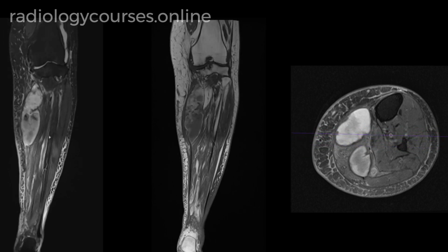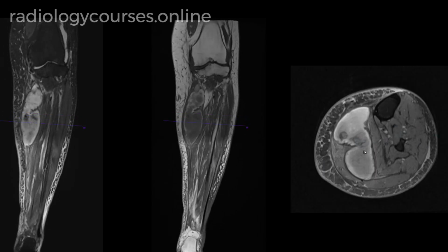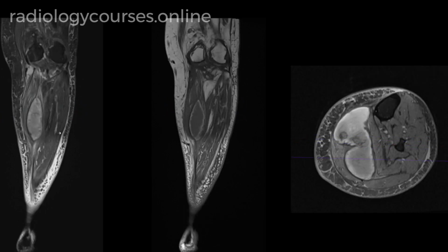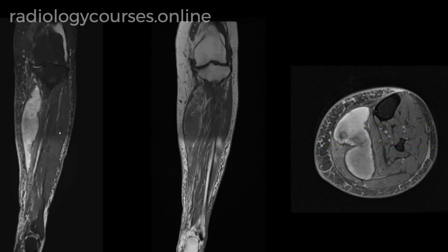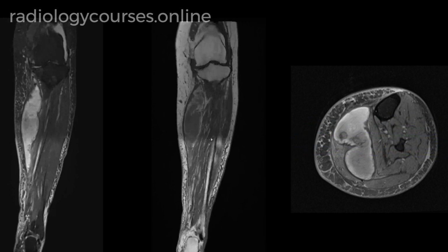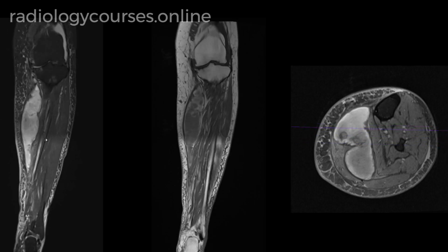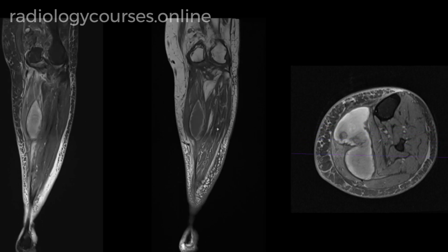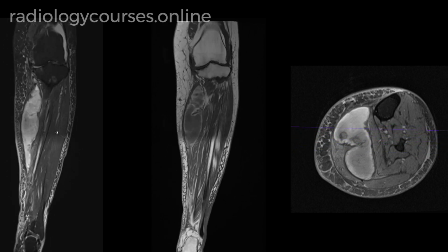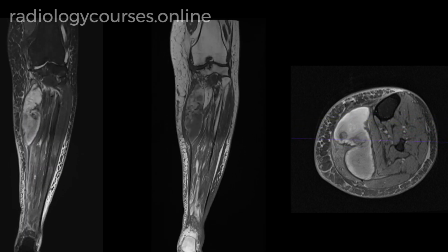So I would suggest the clinical team correlate with serial inflammatory markers and see if they are increasing or decreasing. If the inflammatory markers are normal or decreasing, or the collection is decreasing in size, the features are unlikely to represent an abscess. However, if clinically indicated, it's quite easy to perform ultrasound guided diagnostic aspiration, or it might even be possible to do a therapeutic drainage if abscess is found.